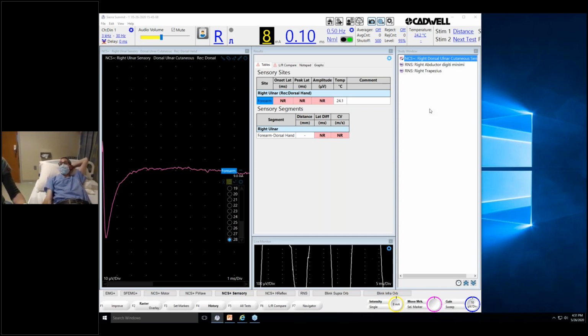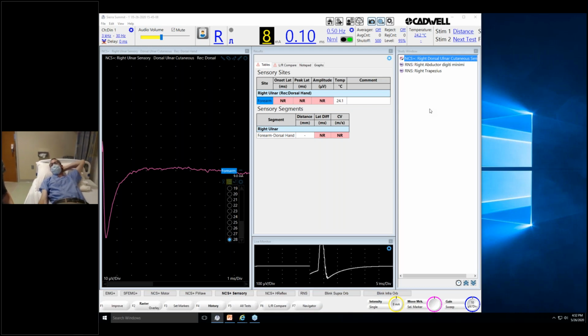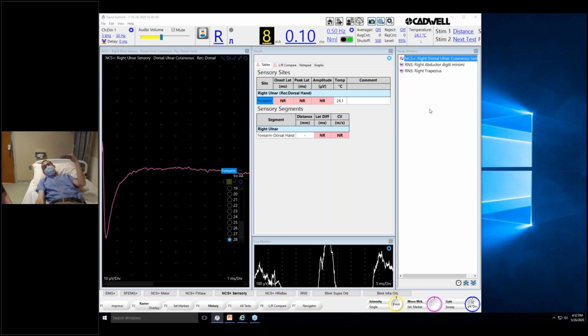I think that's too high, and in milder cases you may call that a false negative if you use 20%. But I think the key point is the decrement has to be reliable, and we often will perform several sets at rest before we have the patient exercise to make sure that the same amount of decrement is occurring with each set at rest. If you have a decrement of 12% and then 10 seconds or 30 seconds later the decrement is 0, that should raise a red flag that there's a technical problem.